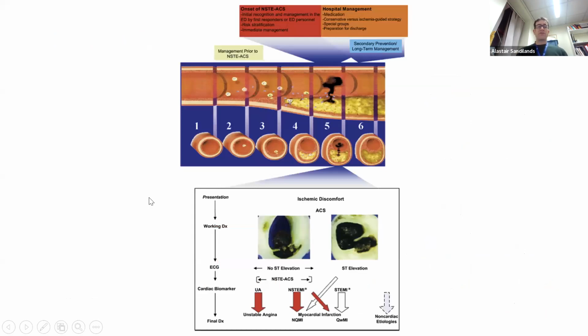So what actually happens? Let's think about the pathophysiology of ST elevation. So really you've got to think about the artery. In ST elevation, this is a cross-section of a coronary artery where the artery is completely occluded. There is no blood flow down the coronary artery. Okay, so the plaque has ruptured, there's a thrombosis inside, and there is no blood flow. So chest pain and ST elevation on the ECG, that is the trump card. Okay, with ST elevation, you will get reciprocal changes, either T-wave inversion on the opposite side of the heart or ST depression on the opposite side of the heart.